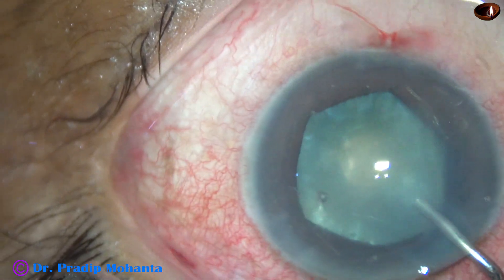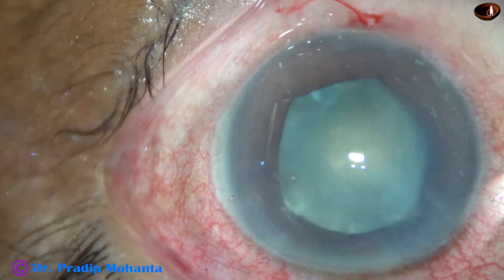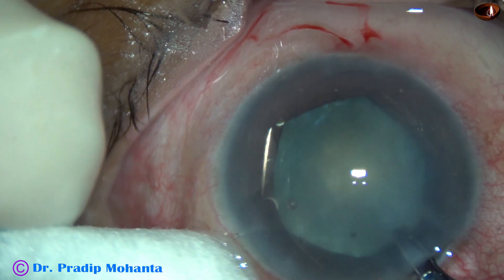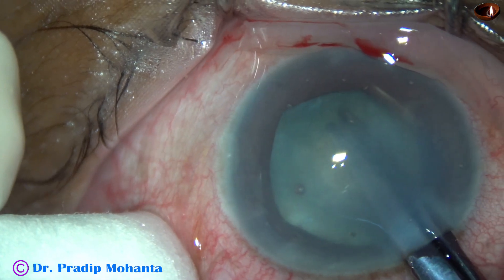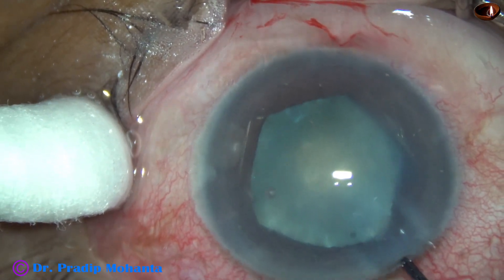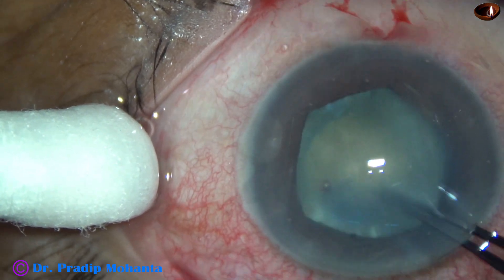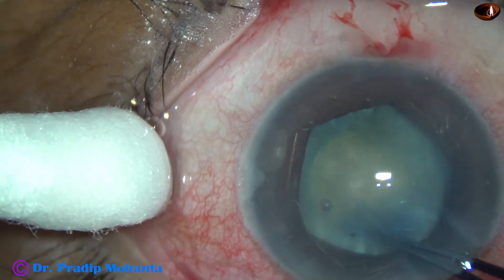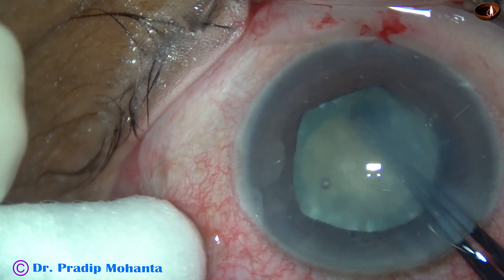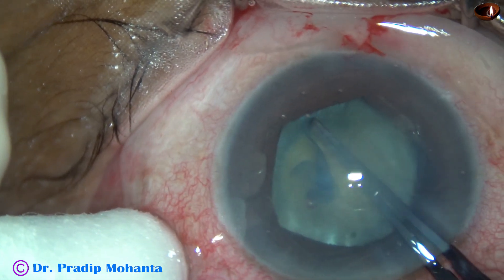Visco is injected to fill the anterior chamber. The anterior chamber is deep now. I take a Vannas scissor and make a small nick at around 6 o'clock, because this area I can see clearly. And now I enlarge the small rhexis into an optimum size rhexis. It is done — very safely the rhexis is completed.